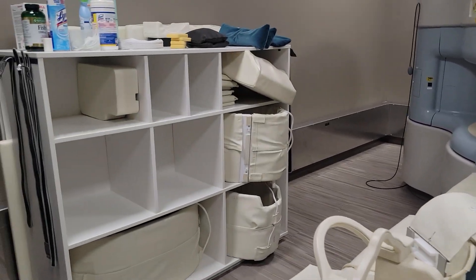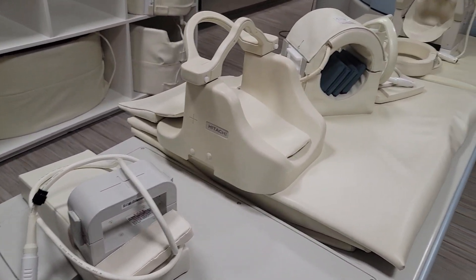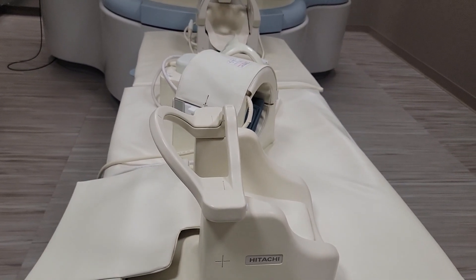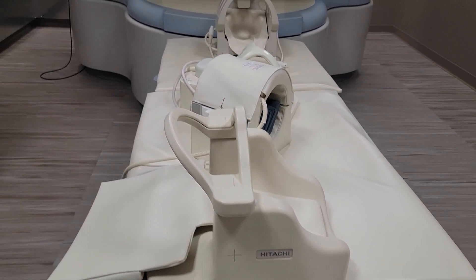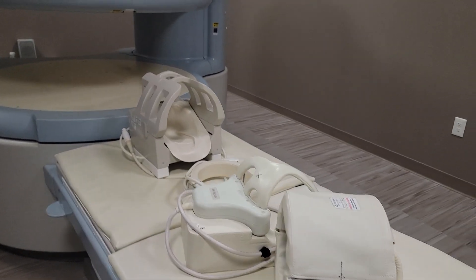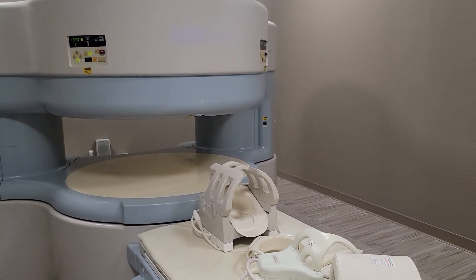Alright, so these are the coils for the Hitachi Ares Elite 0.3 Open MRI scanner, and I'll be doing a video on the interface soon. Thank you.